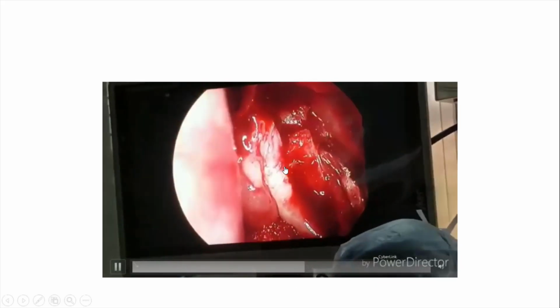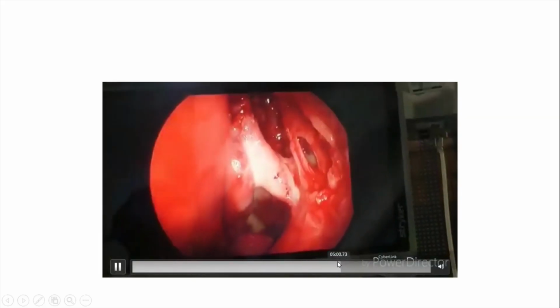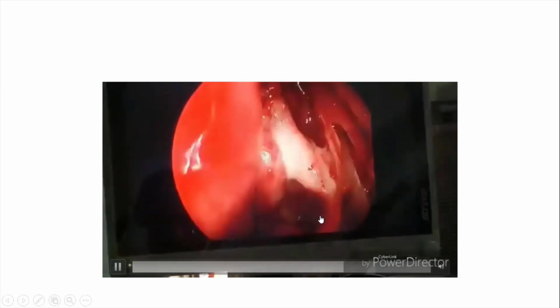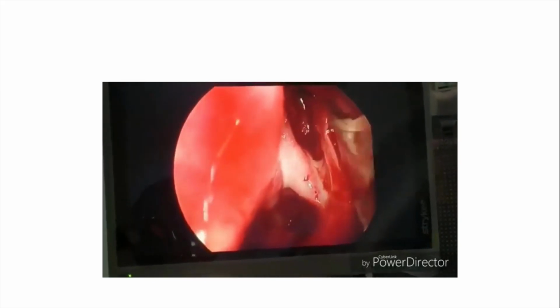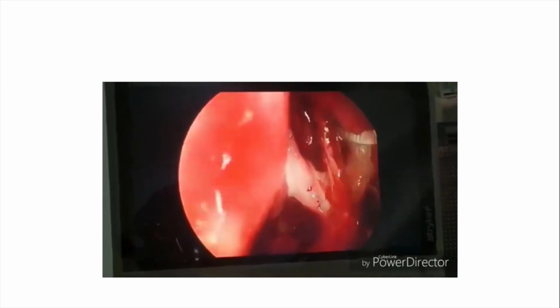Okay, then after that on the sac. Now the incision: the surgeon makes cruciate incisions, either along the flap or along the sac. Once you put an incision, it becomes a medial flap and a lateral flap. Okay, you got the point.